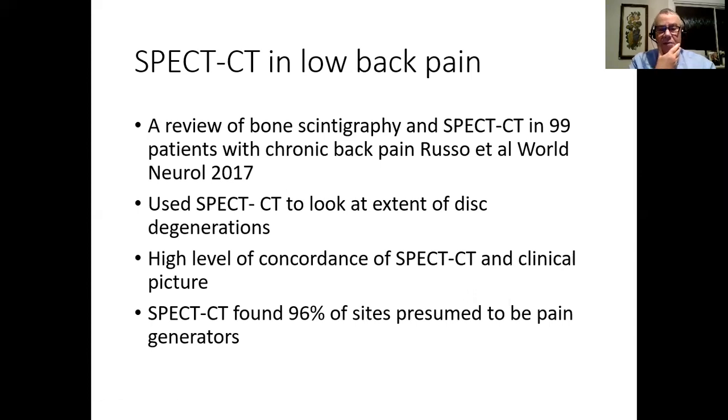And then more recently, there's a paper in World Neurology looking at SPECT-CT in back pain and enabling it to look at the extent of disc degeneration. And they found a very high concordance of SPECT-CT and the clinical picture. And 96% of the sites were presumed to be what's called a pain generator.